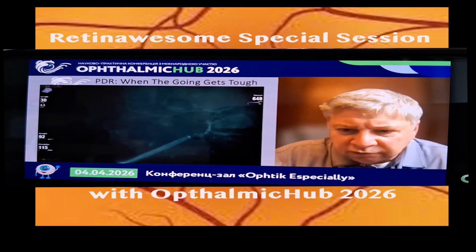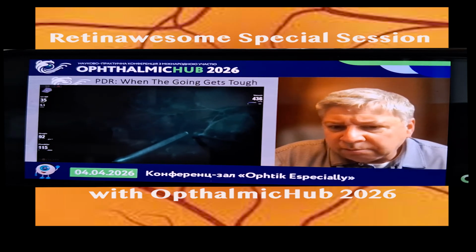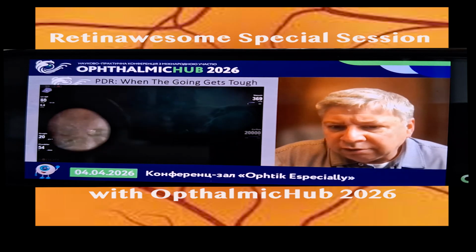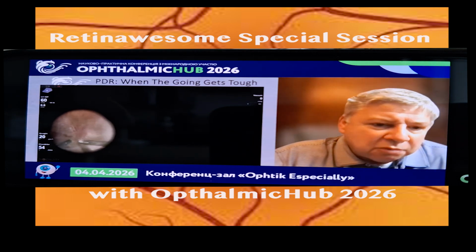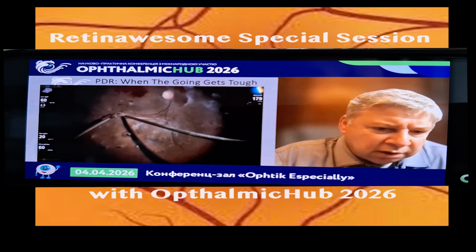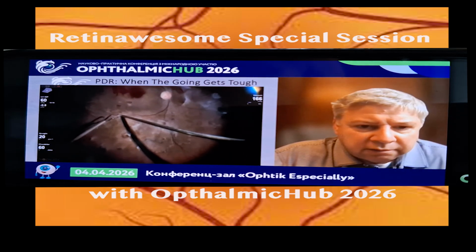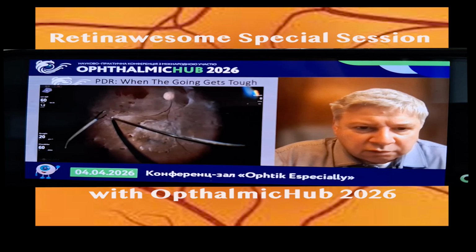Here we're using fluorescein angiography to try to better delineate the preretinal membranes. That helps somewhat, but we're able to get a plane starting in the macula. But here, this is just kind of a mess.